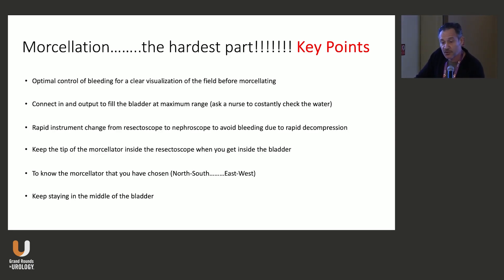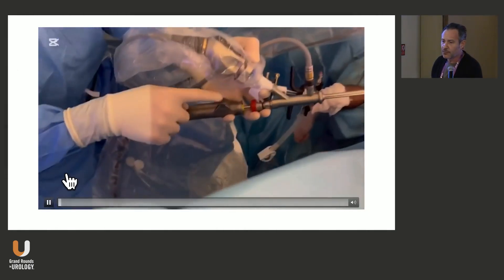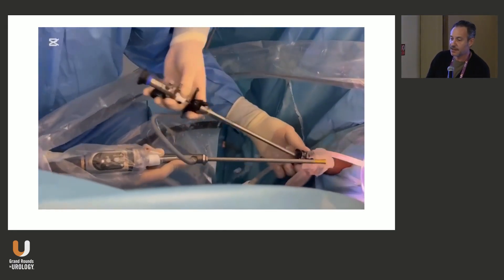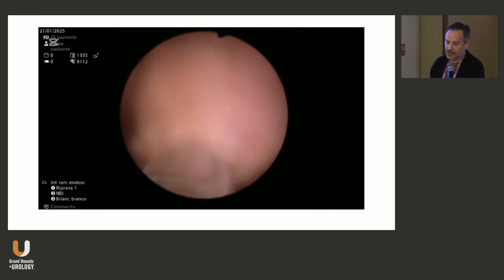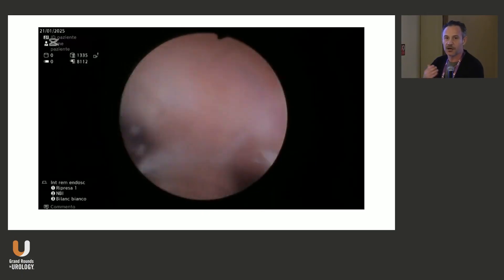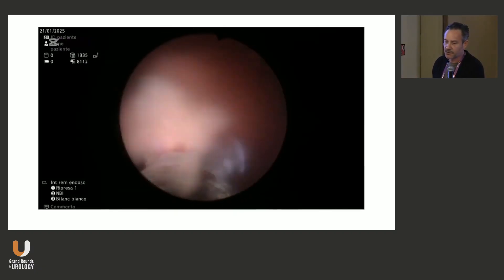You have to know the morcellator you have chosen — there are different ones on the market. Some go north-south, some go east-west, so you have to know when and where it cuts. Keep the morcellator tip staying in the middle of the bladder. Have your assistant take out the resectoscope and go in fast so you don't lose the field. Once you're in, start to morcellate. At the very beginning there may be a little bleeding, but once the morcellator starts with suction, the field becomes much clearer and you will go very fast if your visualization is good enough.